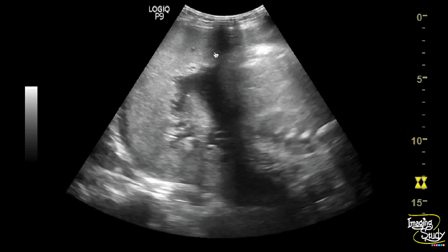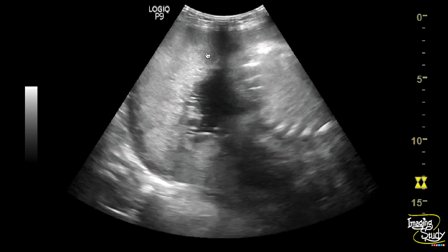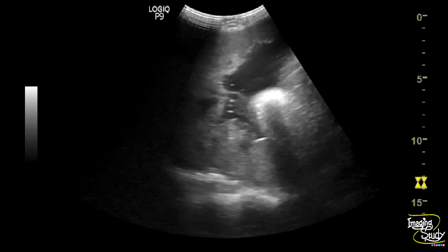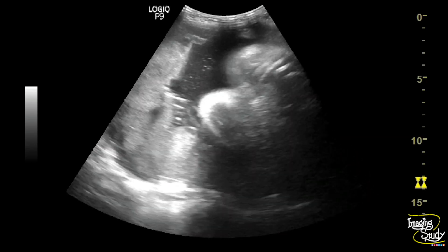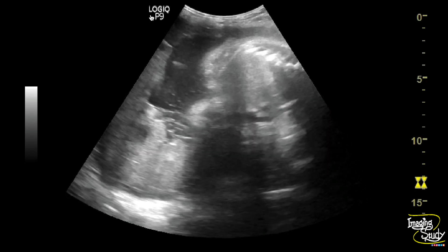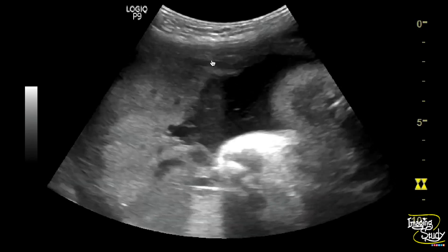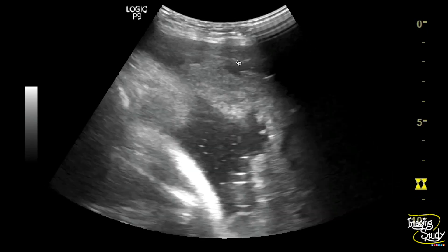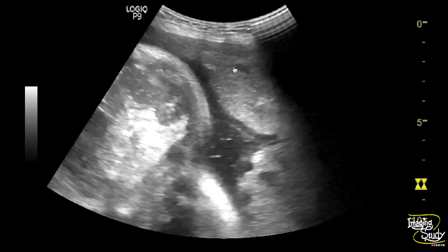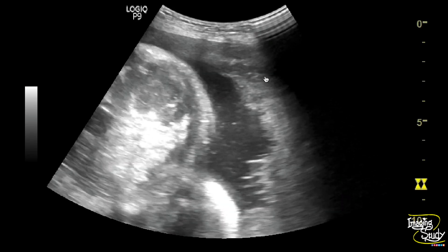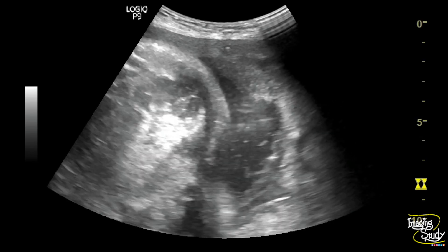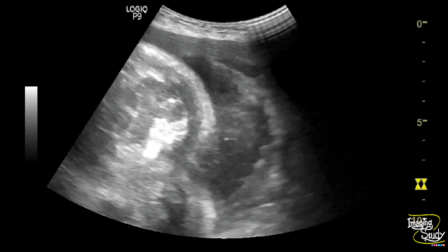Here you can see a normal fundal placenta — there is no definite abnormality seen. But when you magnify the image, you can see a very thin anechoic area at the anterior edge of this placenta. You may miss it without magnifying the image. This anechoic area is the hematoma.